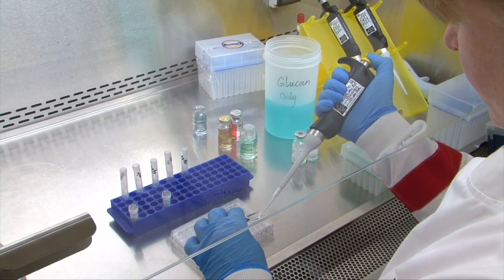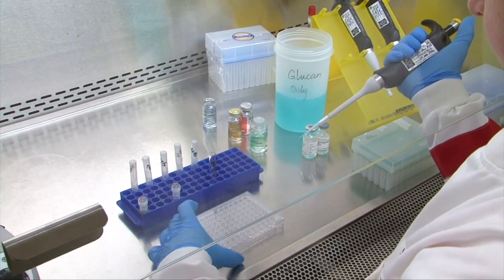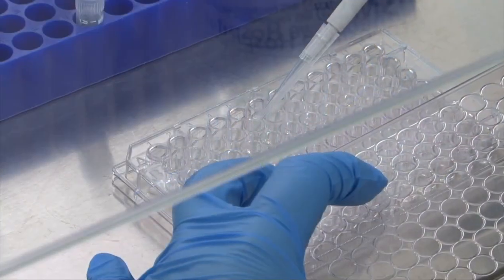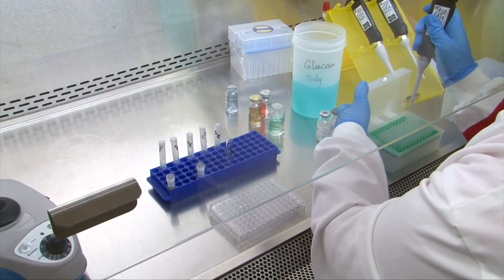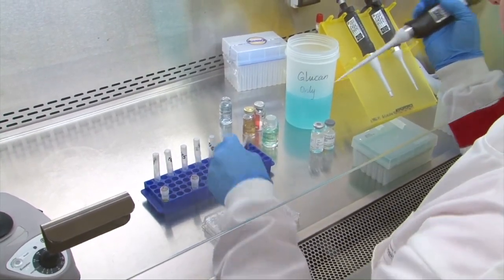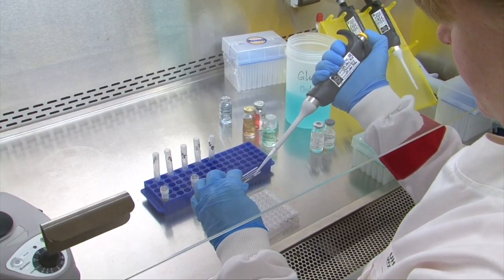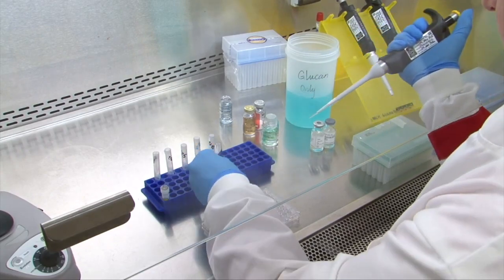Some final comments on the glucan test. It provides a presumptive diagnosis, but of course should be used in conjunction with other diagnostic procedures. It doesn't detect certain pathogenic fungi, for example Cryptococcus or agents of mucormycosis. One of the key features of this test is its very high negative predictive value.